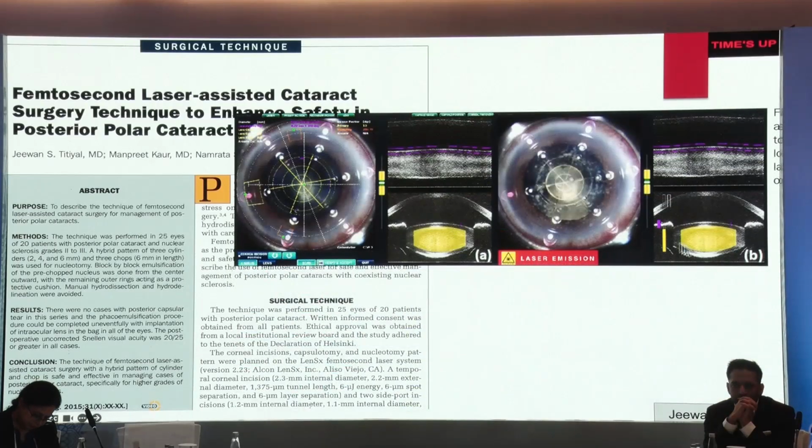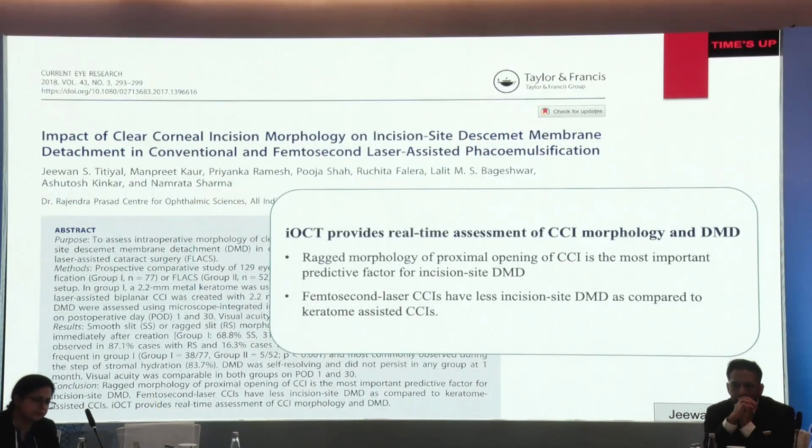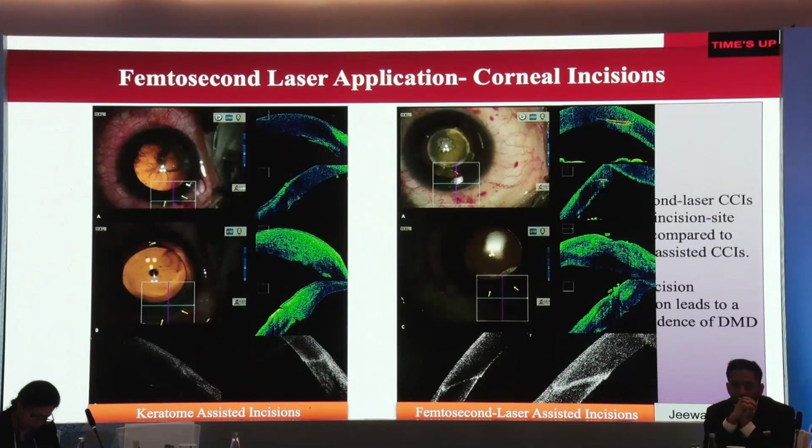Femtosecond, again, I'm showing here. This gives a clear OCT picture of what type of posterior polar cataract you have and how you manage these cases also. Sometimes this imaging is also important for difficult cases where your incision may be a challenge.